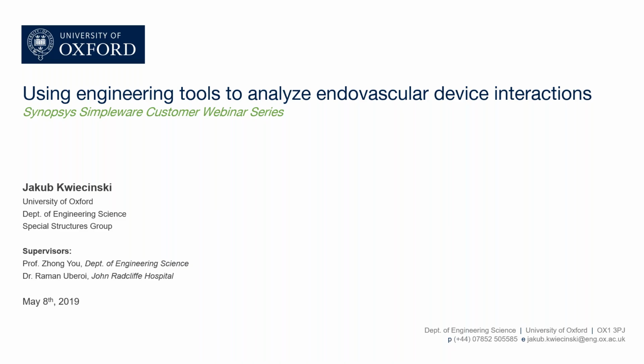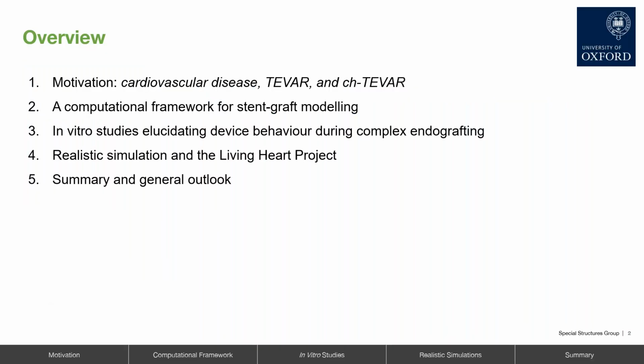So today I'm going to share with you what these advanced endovascular techniques are. Like I said, I'm going to elaborate on some of the experimental and computational tools, and then I'm going to point to two very specific examples of how I use ScanIP in my work to really quantify some of these interesting interactions.